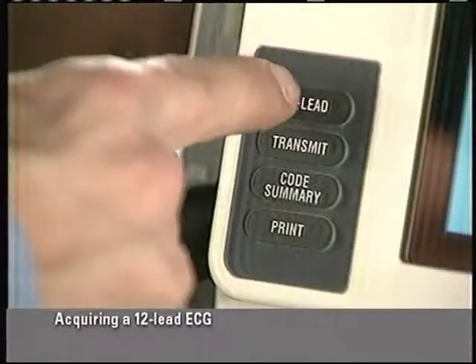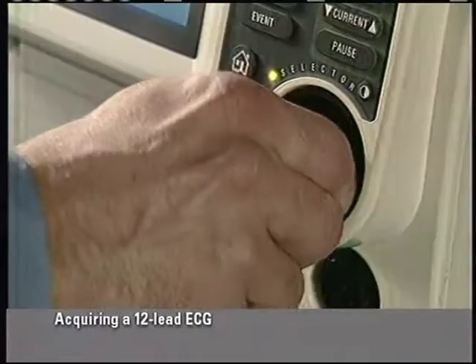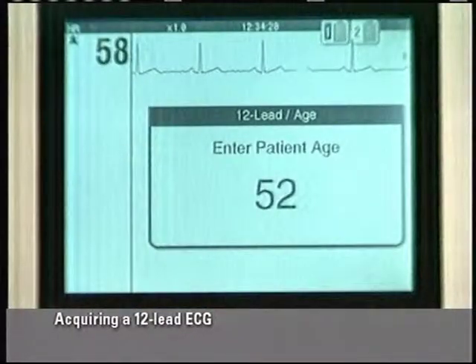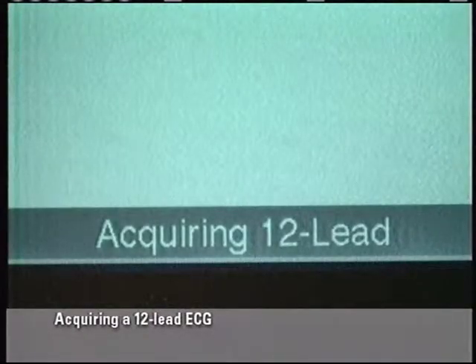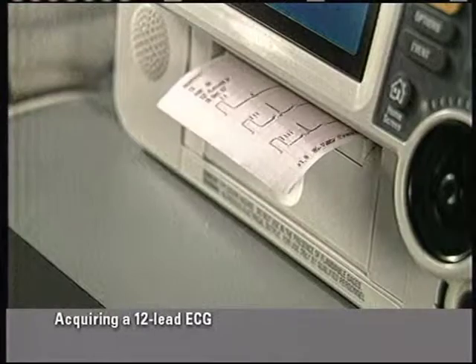Press the 12-lead button. The 12-lead age menu appears. Enter the patient's age with the selector. If an age is not entered, the 12-lead automatically selects 40 and begins acquiring the 12-lead ECG. The monitor acquires, analyzes, then prints the 12-lead ECG.